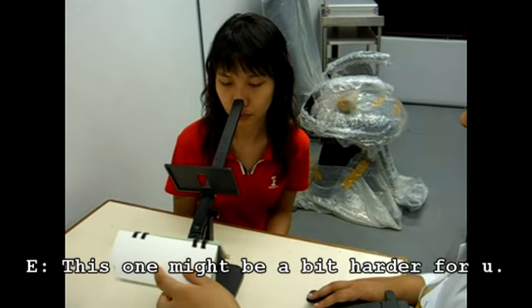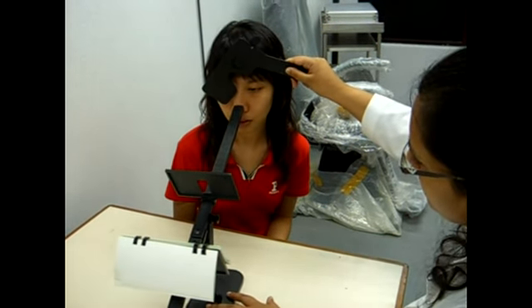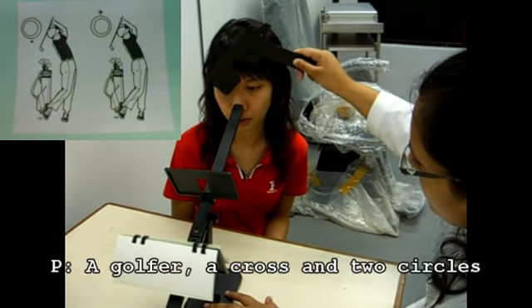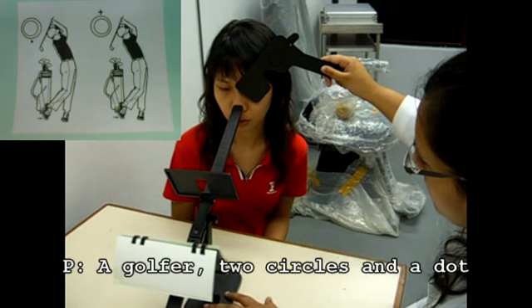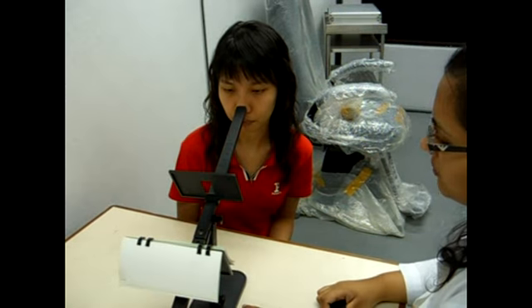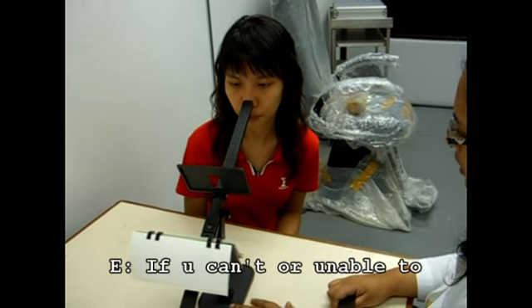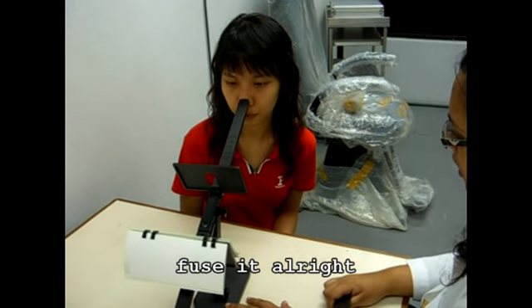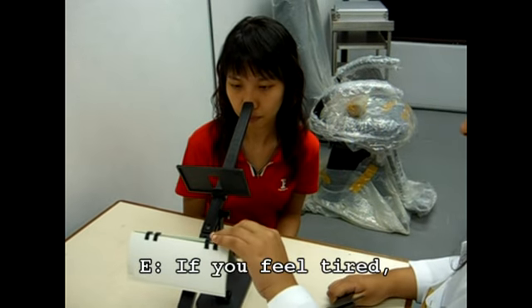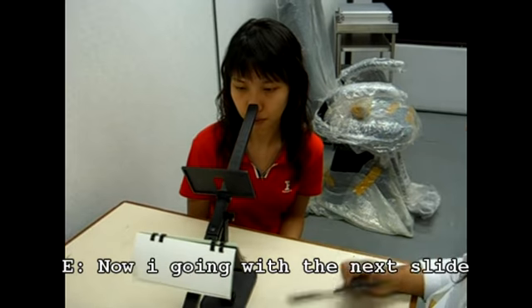This one might be a bit harder for you, but let's just try it. What can you see right now? A golfer, a cross, and 2 circles. A golfer, 2 circles, and a dot. Okay. Try to fuse it. If you are unable to fuse it, it's alright. Yeah, it's fused already. Okay. If you feel tired, you just let me know. I'm gonna go with the next slide.